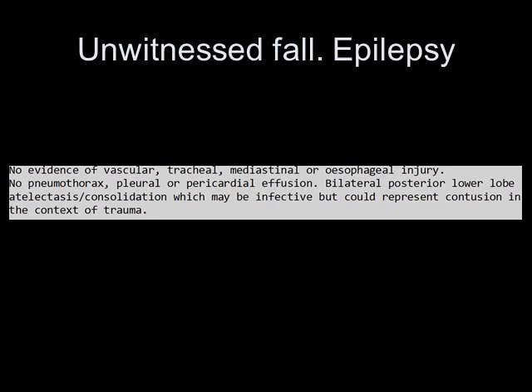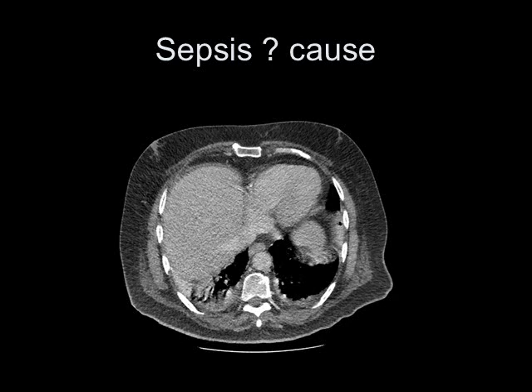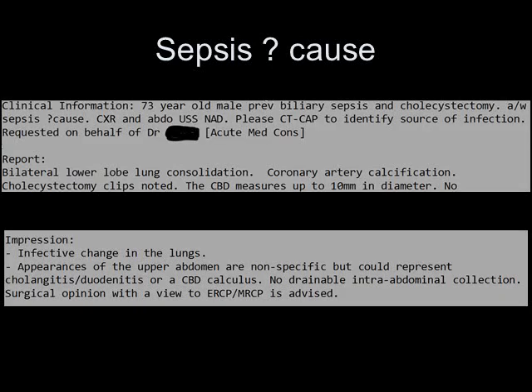It's really unlikely that an individual would have developed bilateral contusional change in their lungs from a presumed fall from standing. Here's a patient with sepsis, query cause — again we have that very characteristic atelectatic pattern at both lung bases symmetrically. Here's the report: bilateral lower lobe consolidation. This patient had presented with previous biliary sepsis and cholecystectomy, admitted with sepsis.